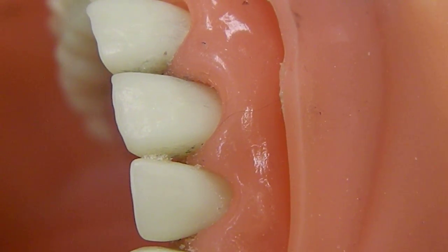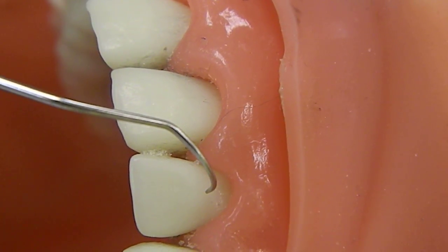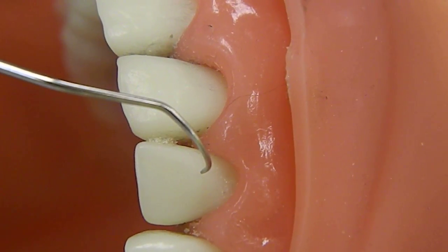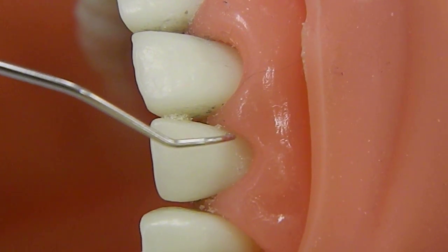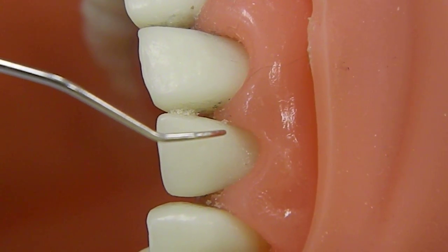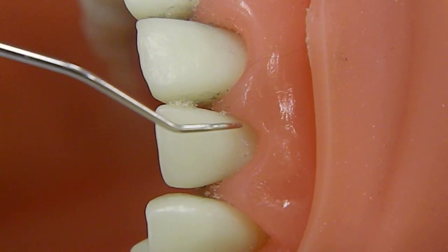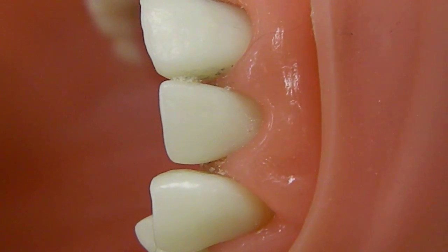If I flip my instrument, you can see here that it wraps around the tooth. It has an appearance of wrapping around the tooth. That is the incorrect technique. This is the correct technique. So for all anterior and posterior teeth, we use the paralleling technique. So this is how I would do anterior teeth. For posterior teeth, it's pretty much the same, but you use a different landmark.